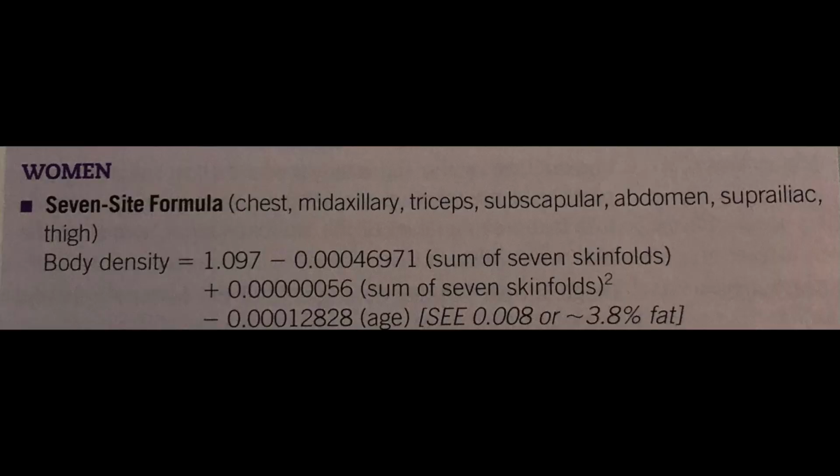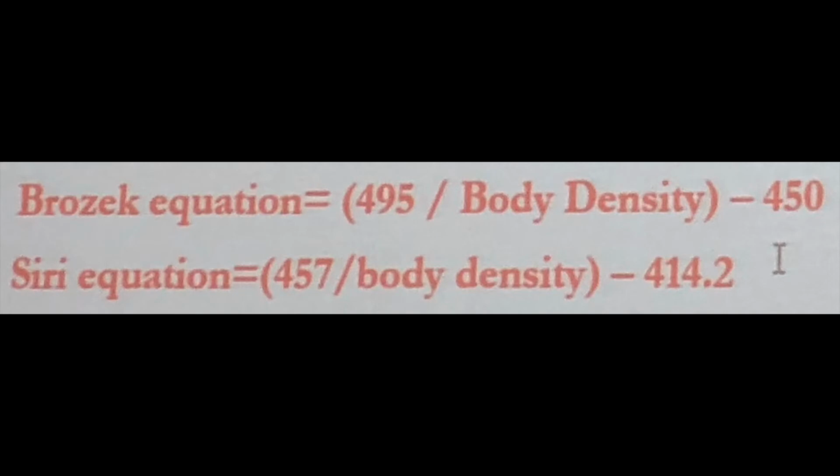These are the formulas that were used to calculate this particular client's body densities. Formulas differ for men and women, so make sure you use the proper formulas.